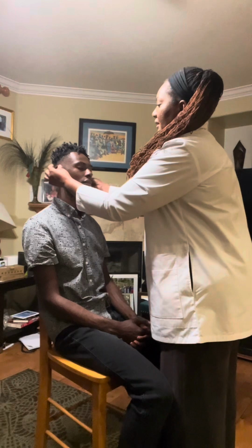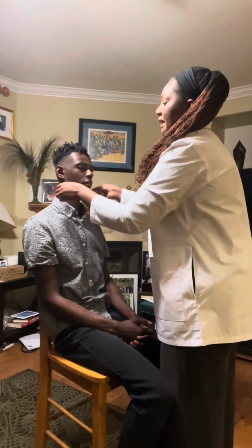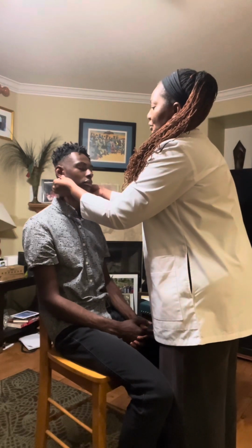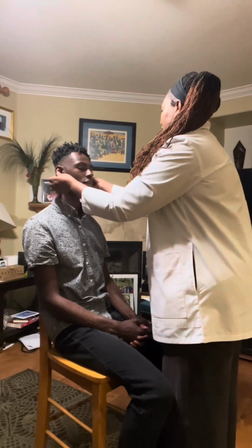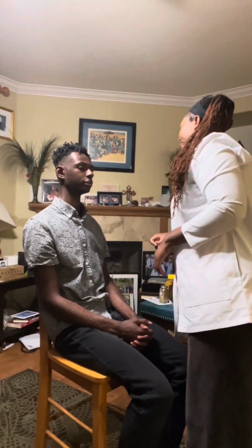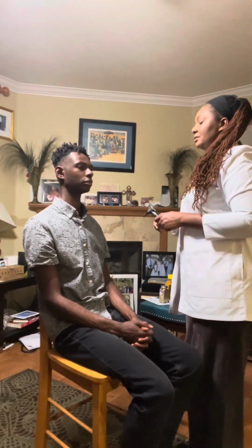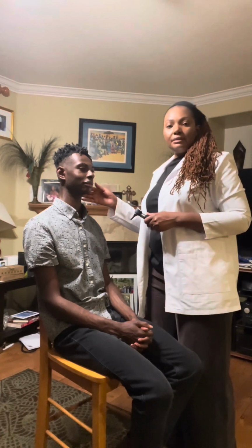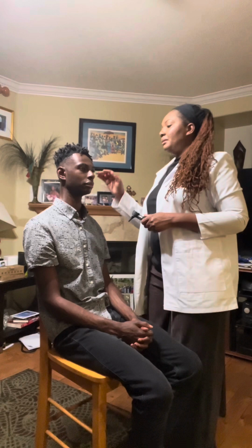Okay, so I am going to palpate. Is there any tenderness? No. Okay, and I'm going to pull down the tragus. Is there any tenderness? No. Okay, and I'm going to look into the patient's ear.